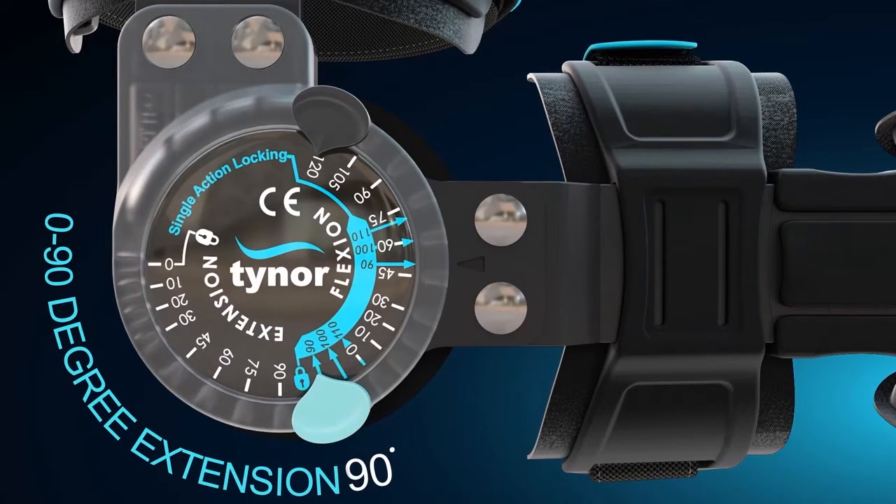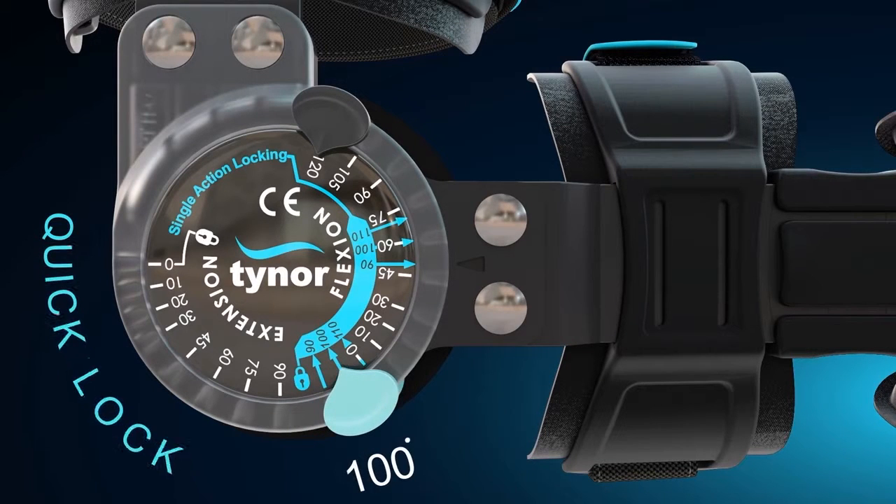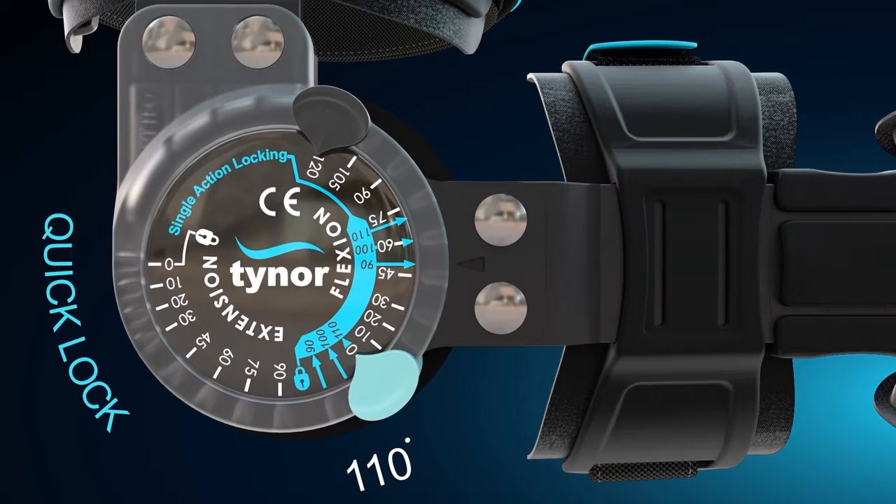This brace can be locked at 90, 100, and 110 degrees for absolute immobilization at any of the three angles.